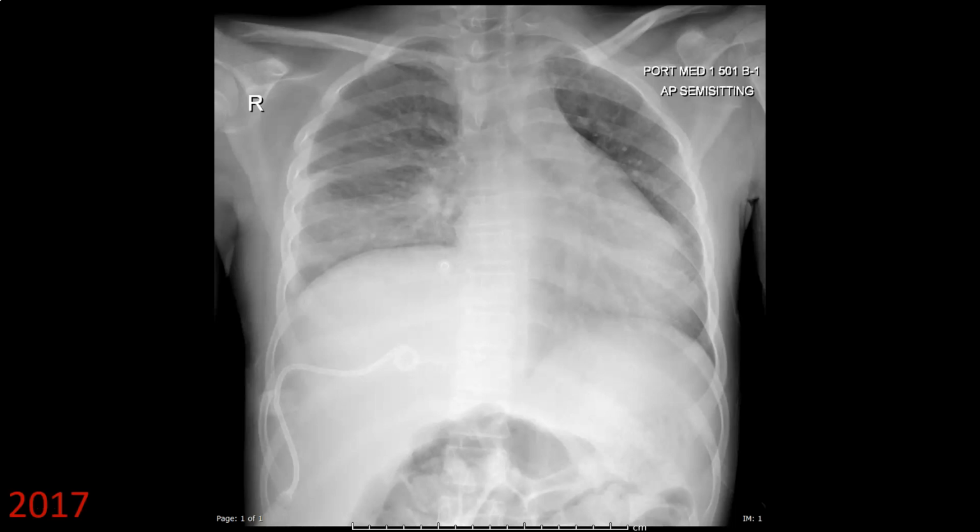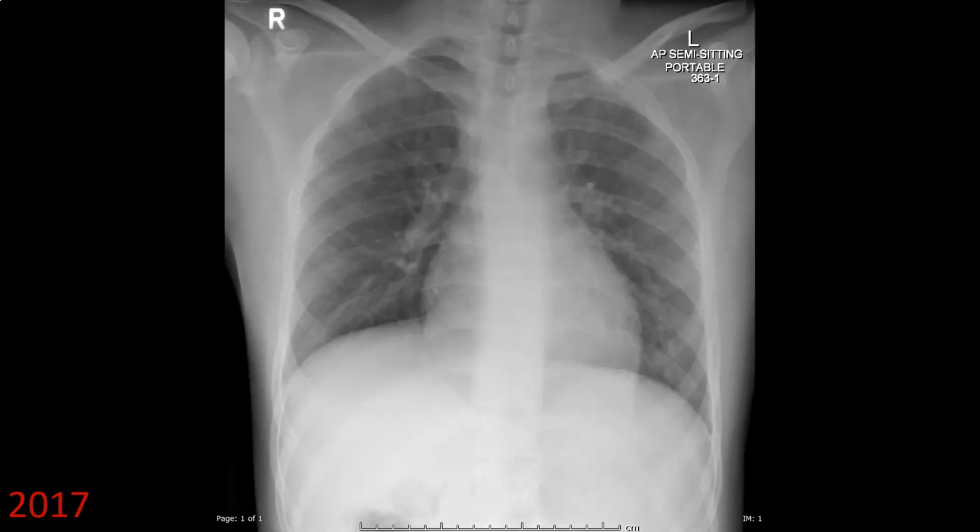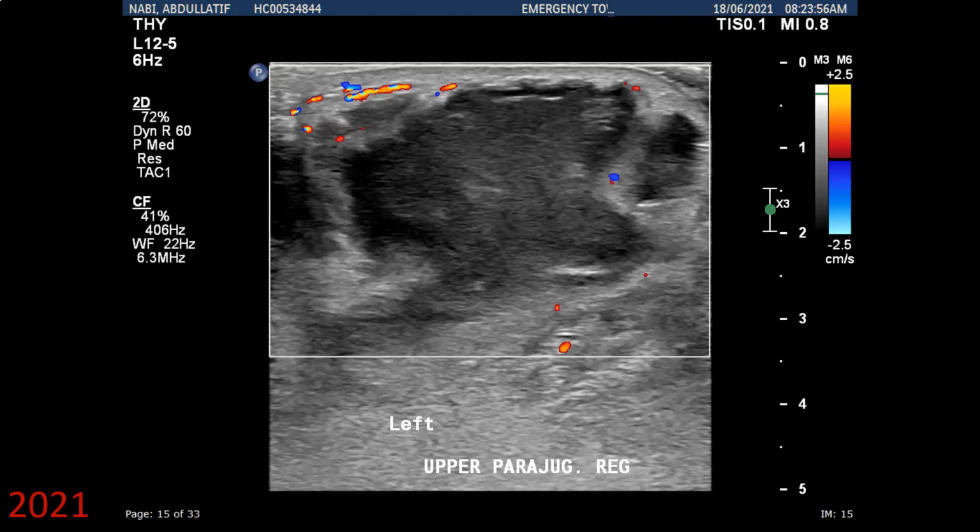The liver abscess has been still drained at that time, and subsequently healed. What is peculiar about the abscesses in chronic granulomatous disease is that they take long time to heal, long time to liquefy.